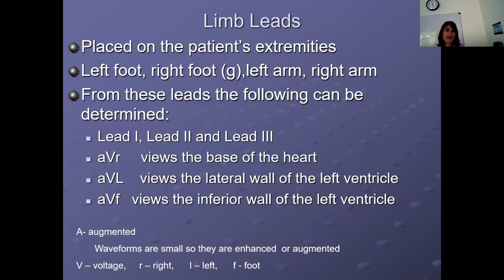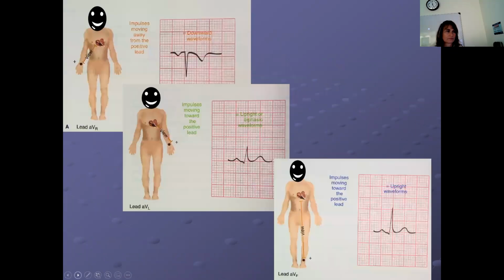And then AVF is on the left foot. So can you add that to your notes? AVF is left foot. And that's looking at the bottom of the heart, or the inferior part of the heart. All right, you got that written in? And then here's a picture of what we were just talking about.